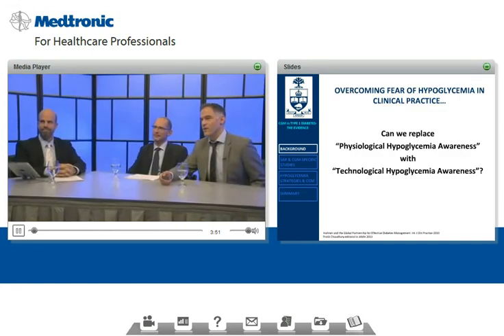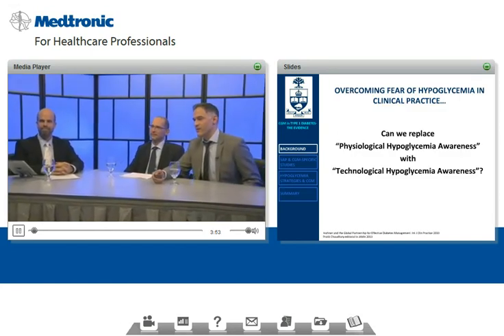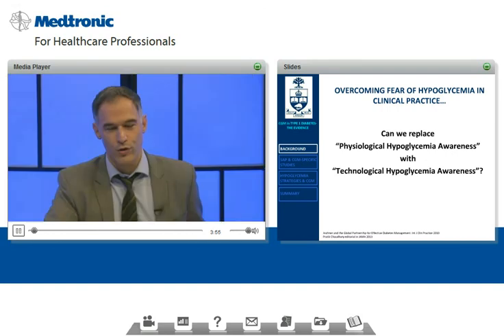So the first thing, by way of context, our biggest problem, I think we would all agree, and I could talk for more than 20 minutes about this, is the concept of fear of hypoglycemia in clinical practice. It sabotages so much of what patients do and even what providers do to get target A1C. And so to me, a big question is, can we replace the hypoglycemia awareness that's physiological? So are we sensing hypoglycemia?